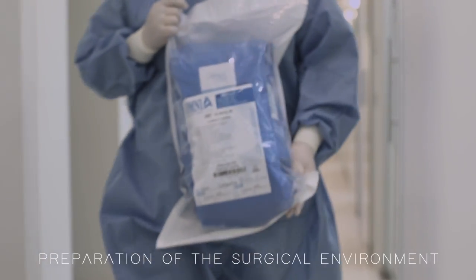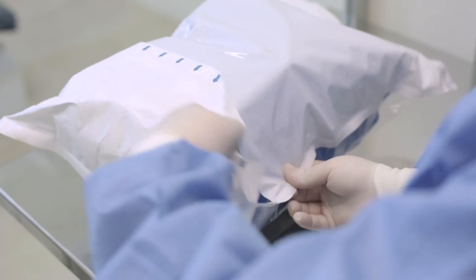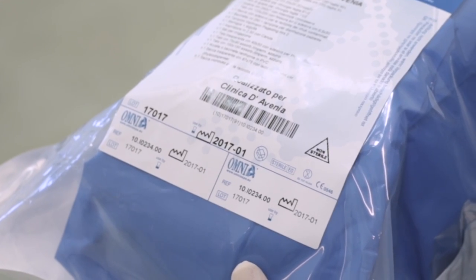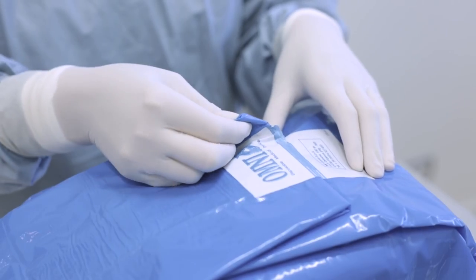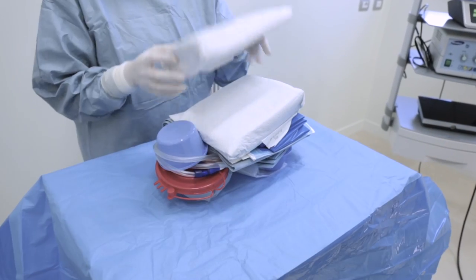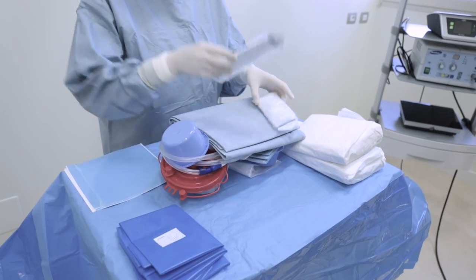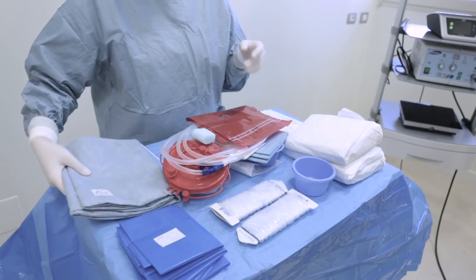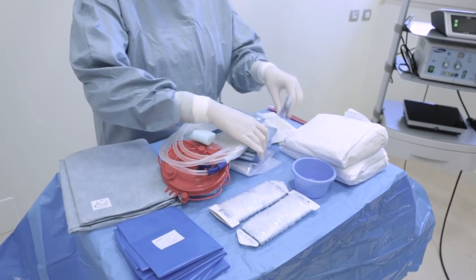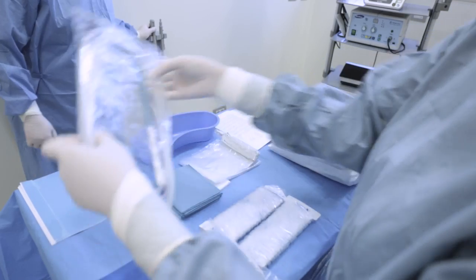The non-sterile assistant places the procedure set on the operating table after checking the integrity of the pack. Traceability labels must be conserved in the patient records. Easy opening prevents pouch fragments from contaminating the operating field. Set contents are wrapped in a wrapping drape that will remain on the operating table, where the surgical instruments will be placed after setup. Devices included in the set are placed in order of use for a faster and more ergonomic operating room setup.